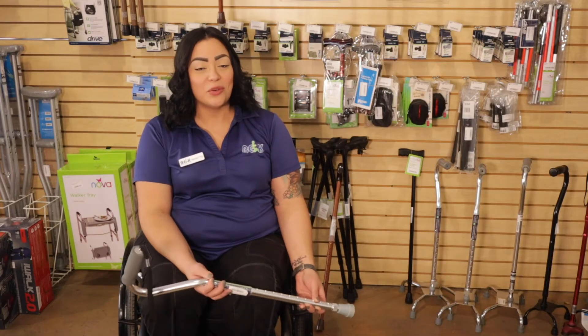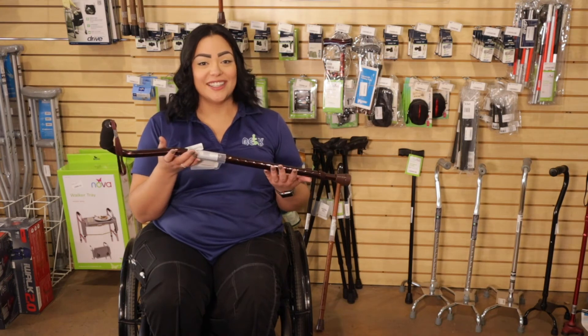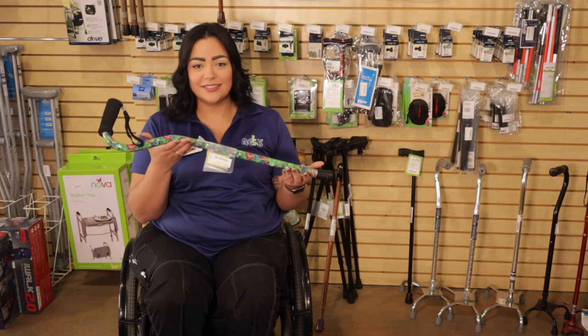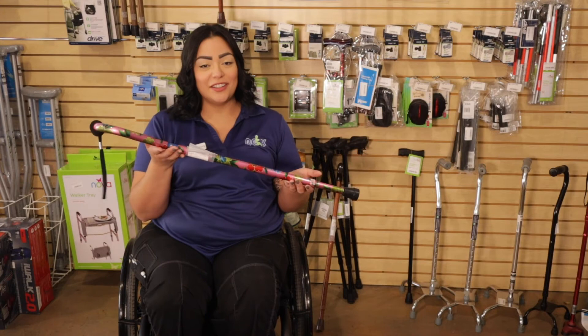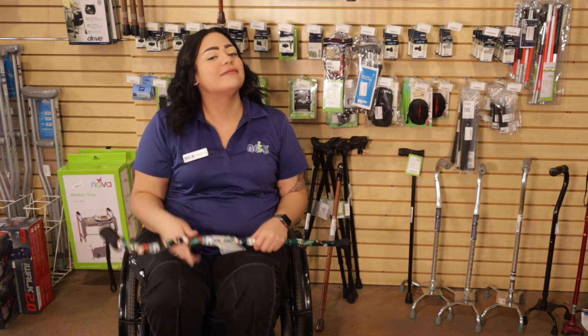Now we're going to talk about our one point cushion grip. We have different colors such as chrome, black, copper, green flowers, nature, red flowers, multicolored flower, American flag, B3, and bingo themed.